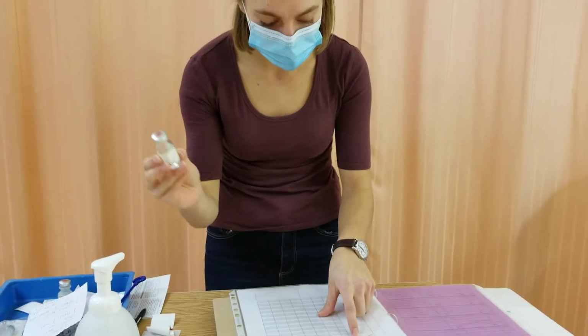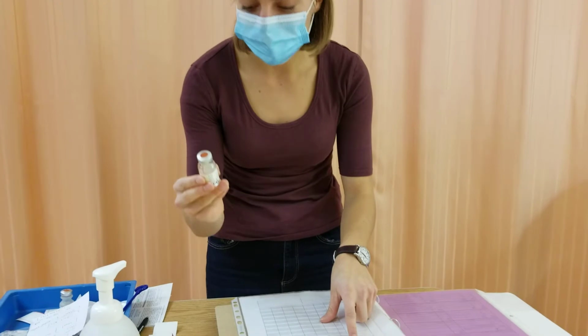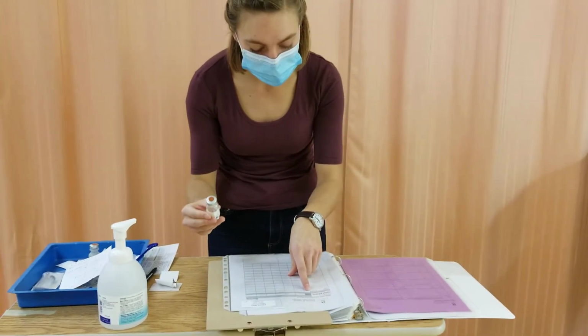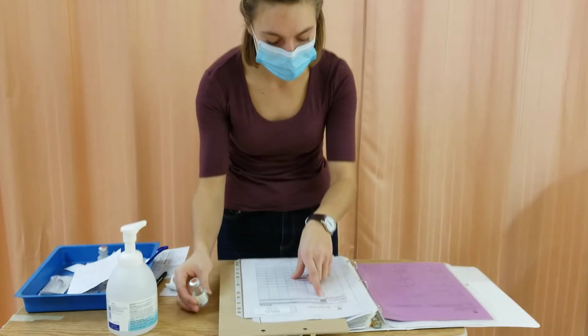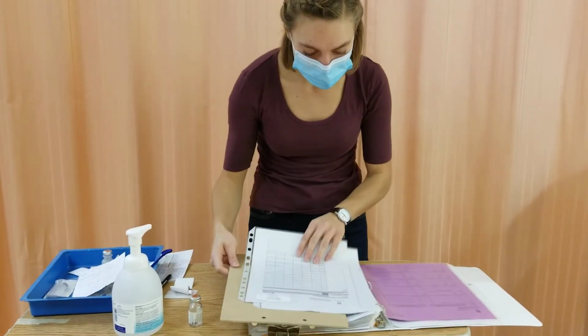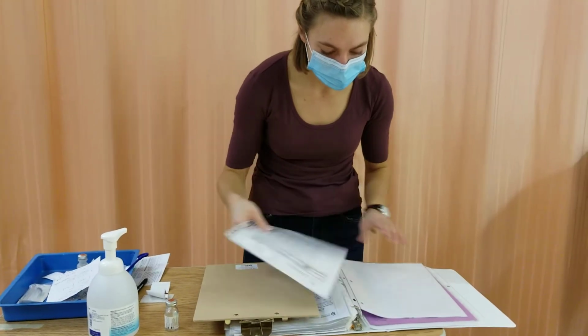There's 1,000 milligrams in here, so that's enough to begin the IV, and it says here IV use every 4 hours, and the time right now is 5:45, and it's due at 6 o'clock, so I can give this medication right now. I'm going to now look at the monograph.